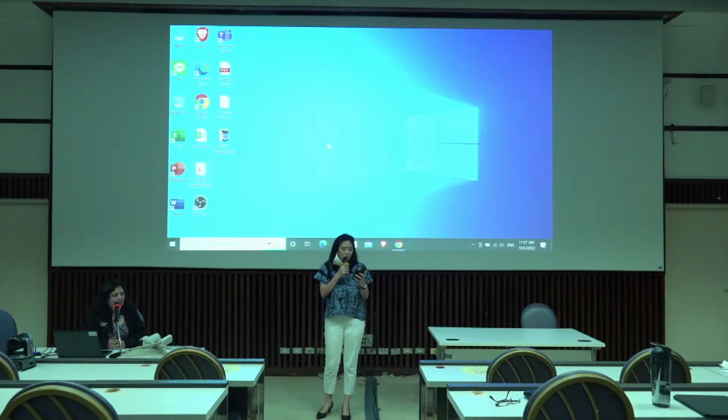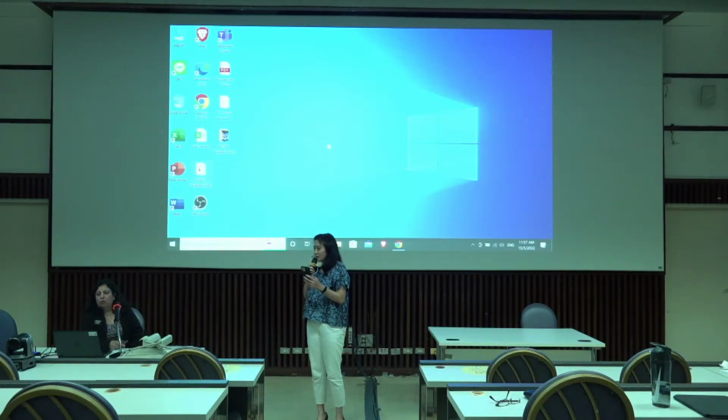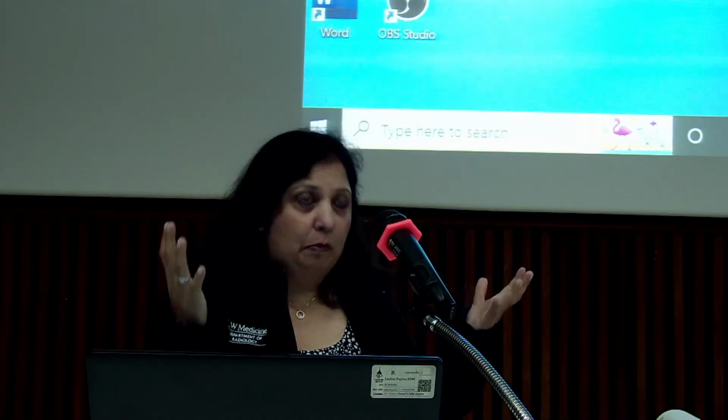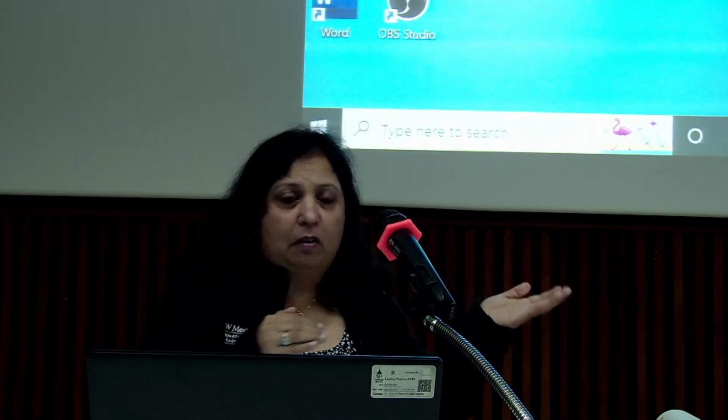Okay, we have a question from online. Do we have to track peak skin dose at two threshold levels, such as 3 gray and 5 gray? Yeah, so the threshold level that you pick depends on you and your hospital. All hospitals are different. We picked 5 gray because, in the table that I showed earlier, it's beyond 5 gray that you start seeing irreversible skin effects.